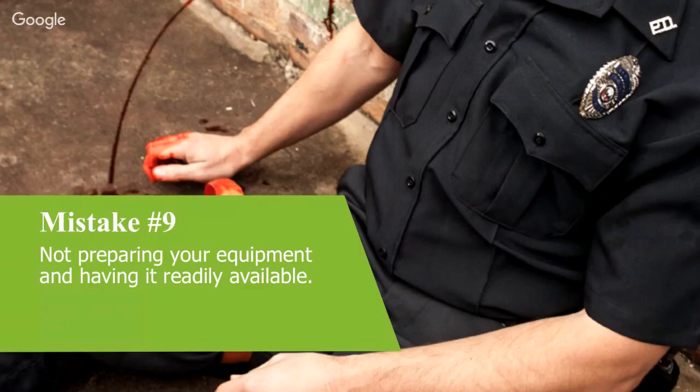You know, and that was, I think, post the study that came out in 2011, I think it was, Dan, where they tested 166 tourniquets that were exposed to the Afghan environment operationally for a 6-month period, and they tested them against 166 new or non-exposed tourniquets, and they found that of those 166, 14 of the tourniquets broke versus none that were essentially new. Interestingly, they also were only 61% effective. So for the ones that didn't break, only 61% of them were effective versus 91% of the unexposed tourniquets.